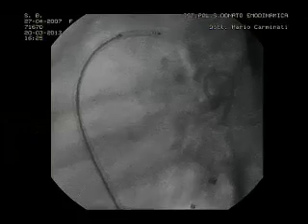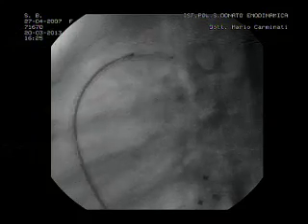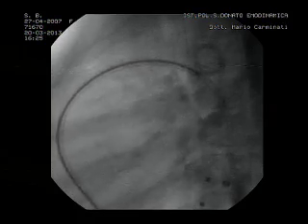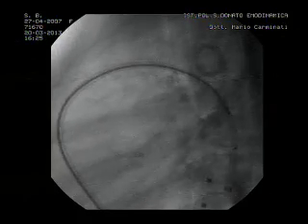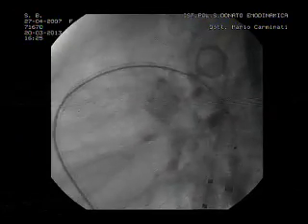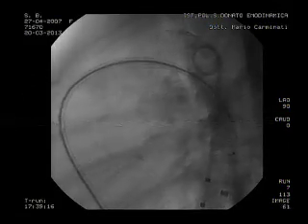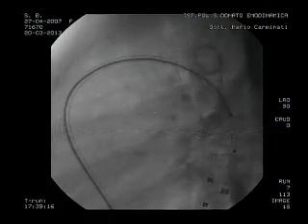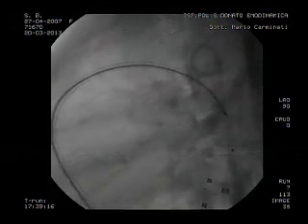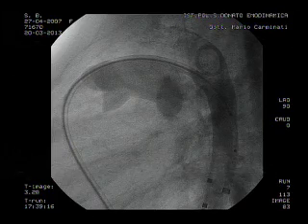You say French. Let's do an angio just to see with the sheath across how the duct looks. Go. Okay. So the sheath is not occluding the duct. Can you stop and have a still frame here? All right.